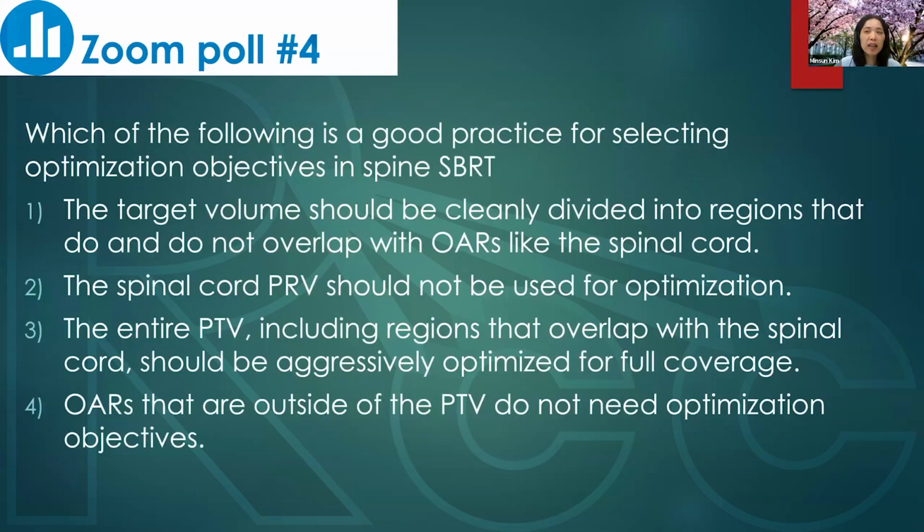And how about 4D CT? Do you do 4D CT for spine locations? We used to, especially when we were first starting, to make sure that there wasn't any clinically relevant motion, because the anatomy around the spinal cord doesn't move a lot with respiratory motion. The spinal column generally isn't moving, and neither are the organs at risk that you might want to spare. And so we stopped doing 4D CT for those cases.